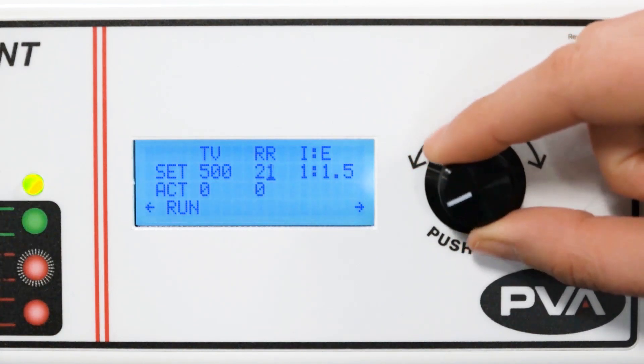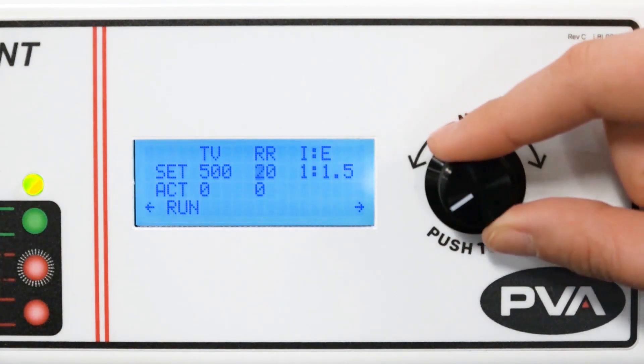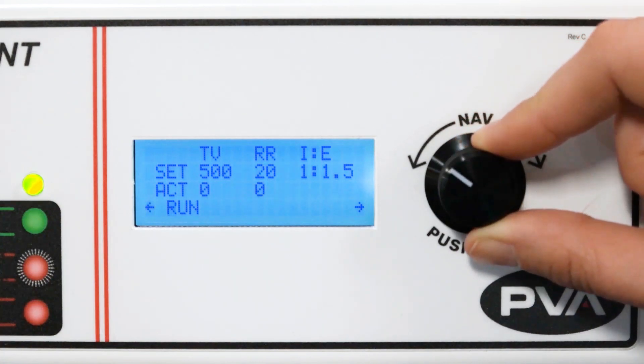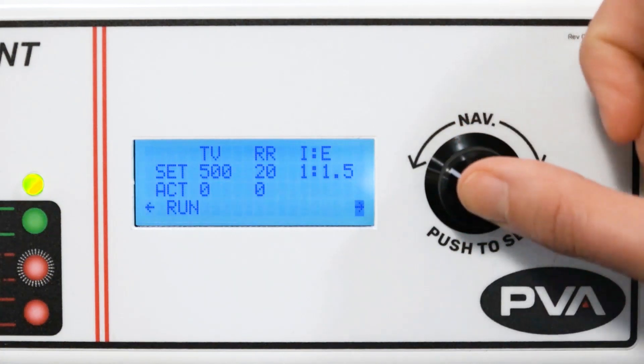If no settings are selected, the system will use the defaults. Once you have set the parameters, use the knob to navigate to the arrow and press the knob.